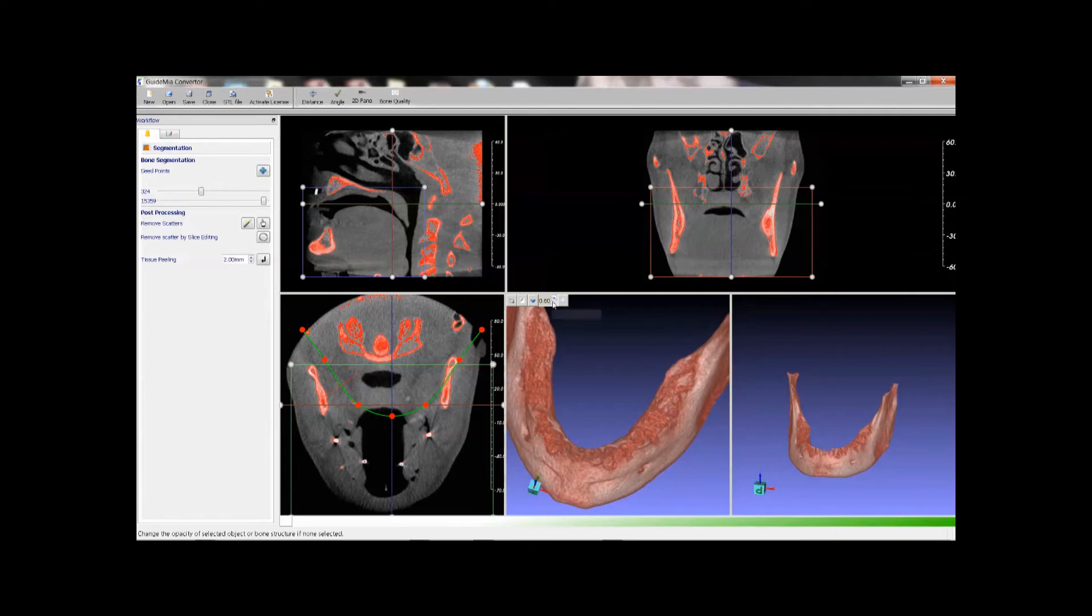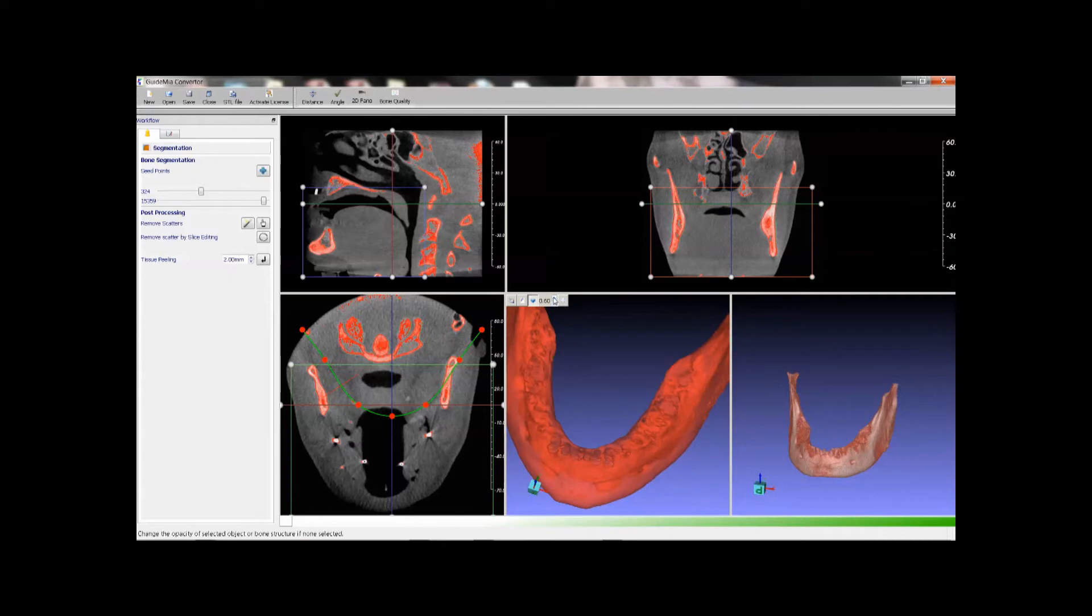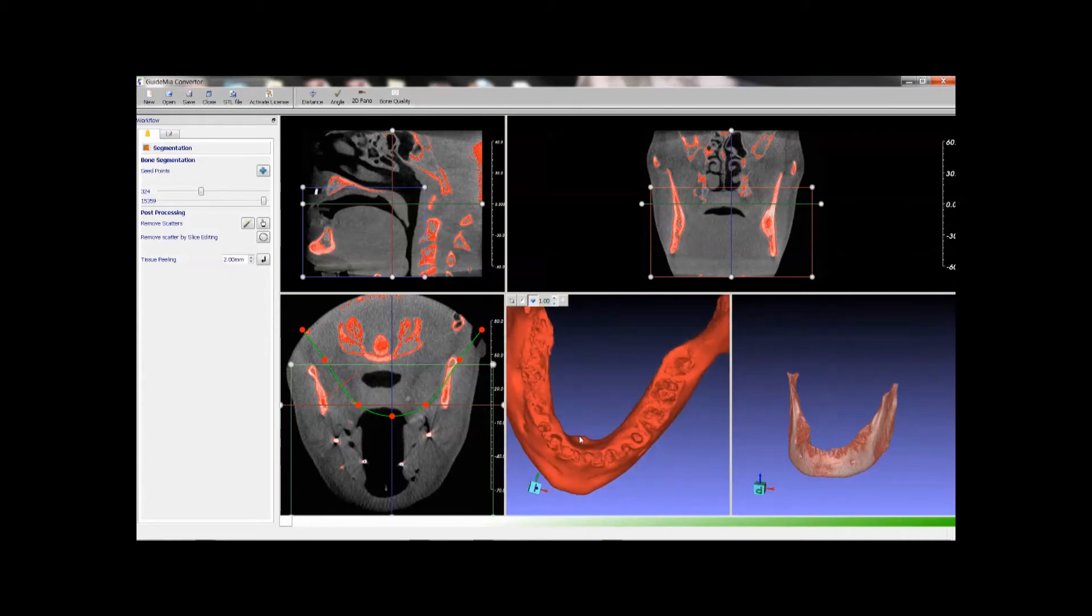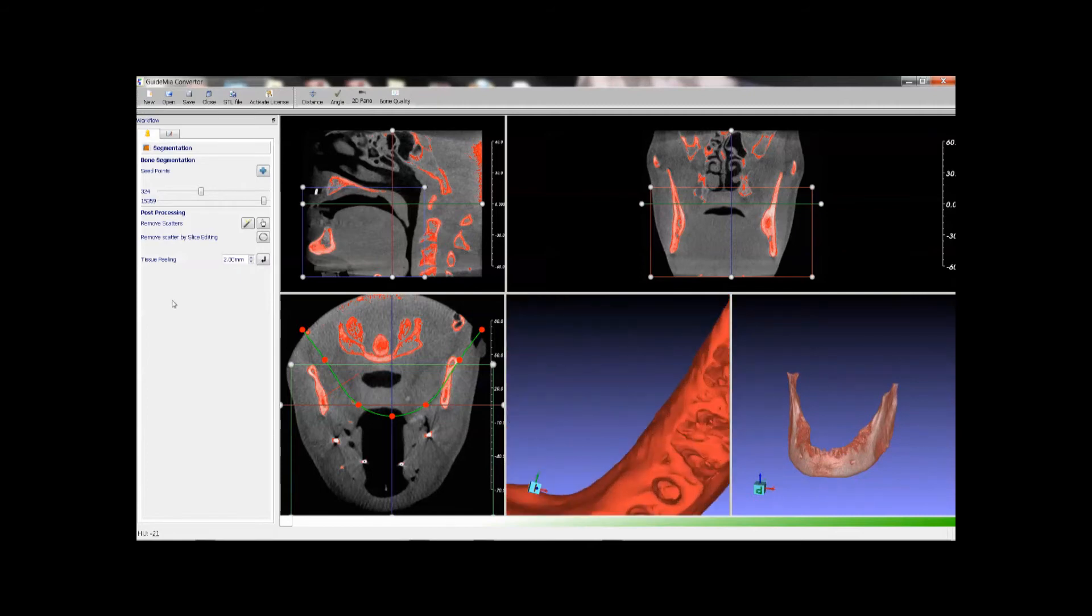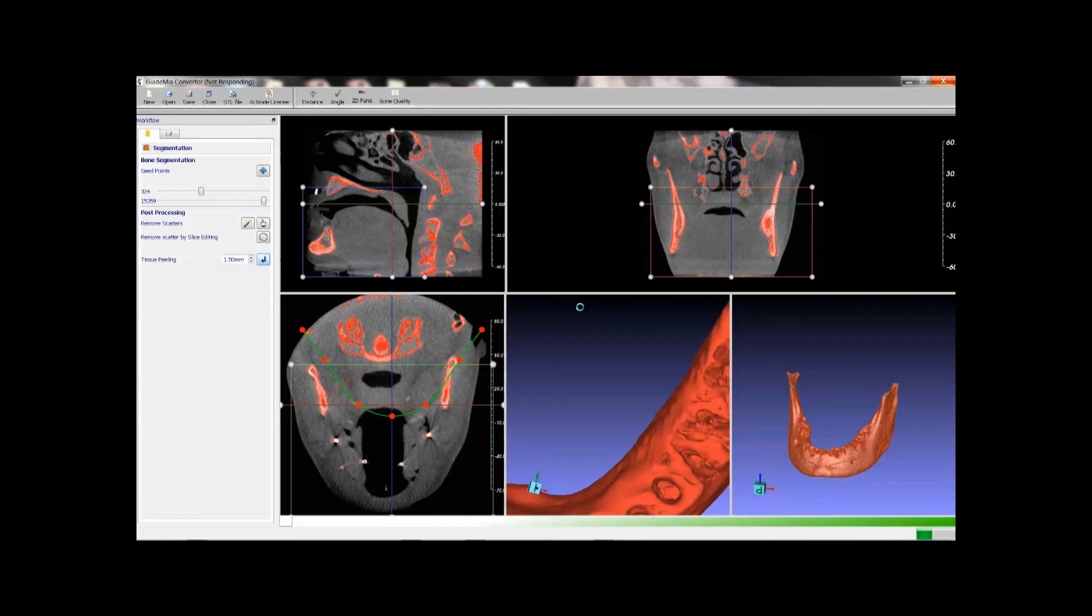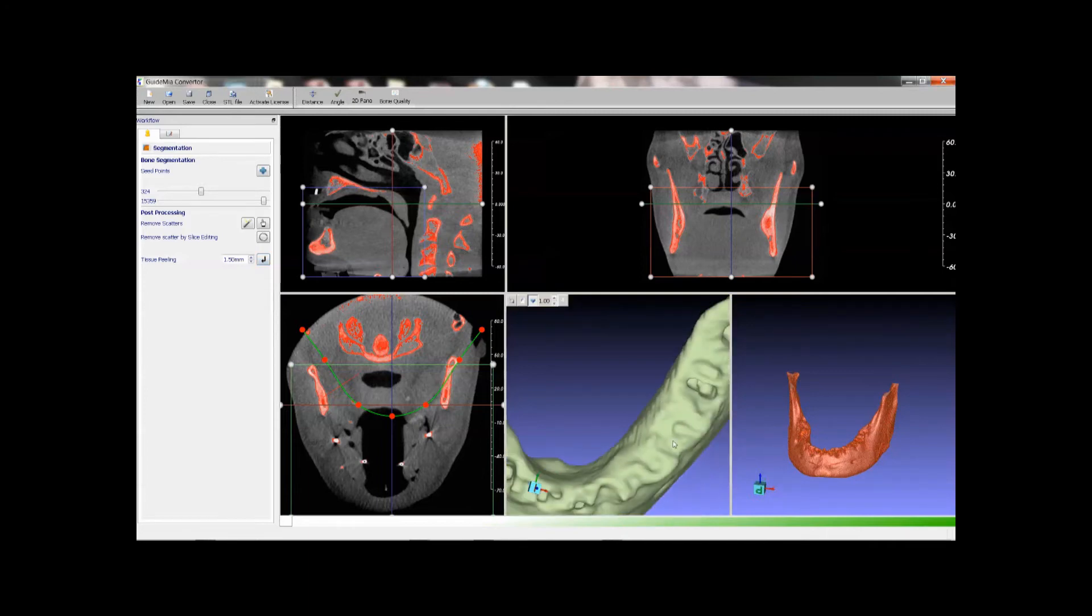Generate the surface rendering. We can notice there are many holes and pockets in the model because the patient bone structure is very loose. Now we use our tissue peeling function to fix the model. Give it a rough hole size.